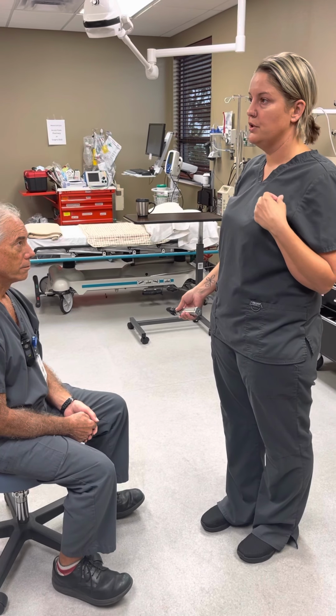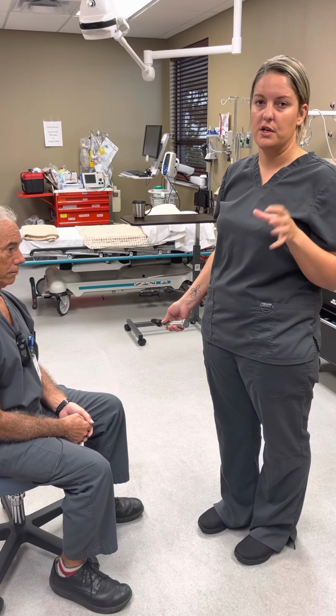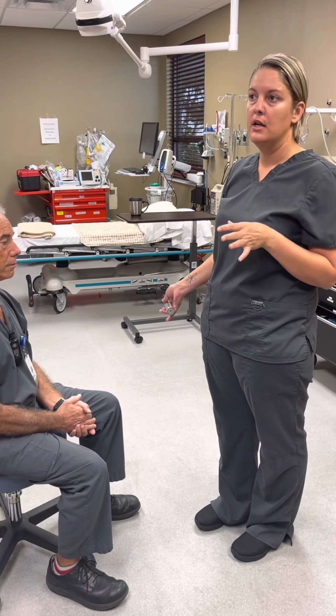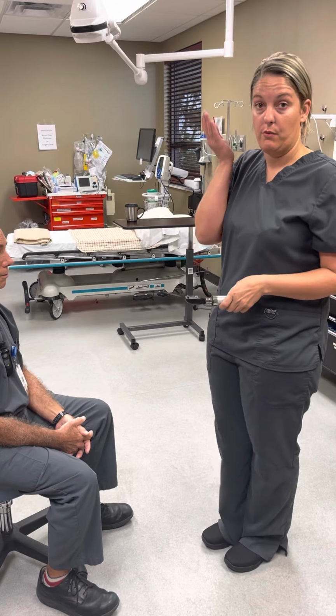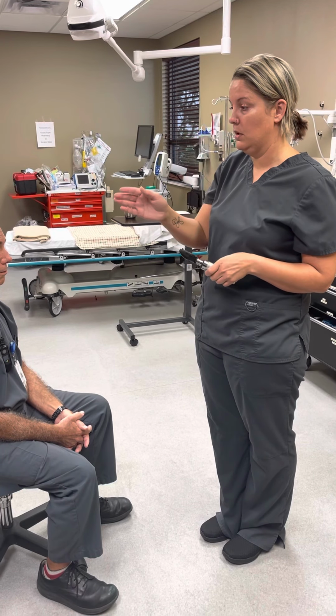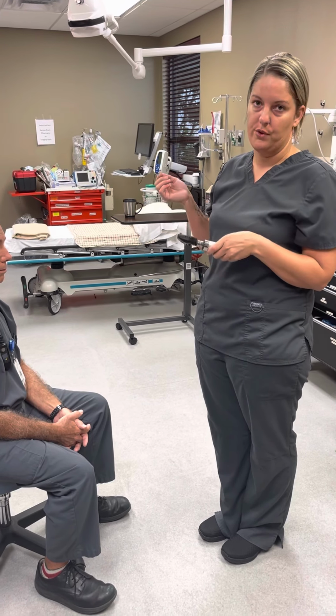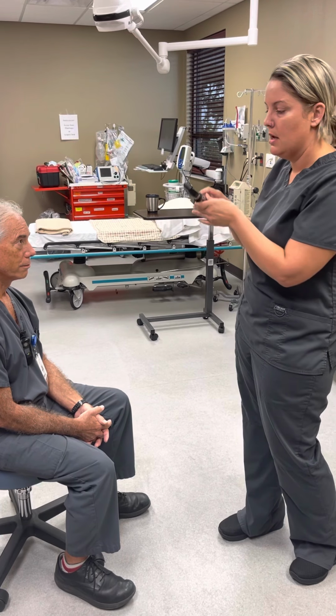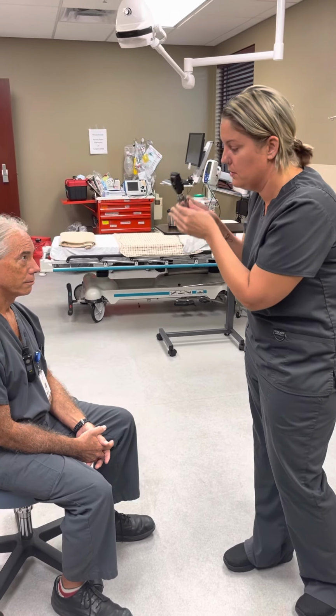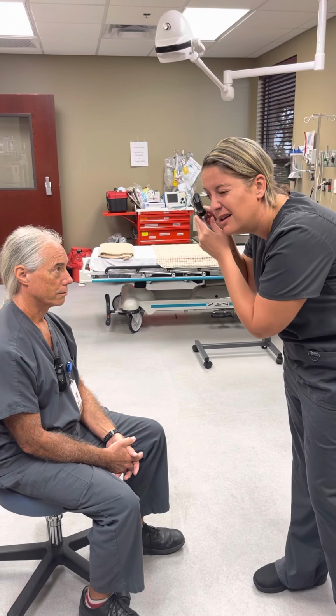And then you test for red reflex, which works best in a darkened room, but for video purposes, we'll have the lights on. So I will look through with my right eye, and I'll look through his right eye, and you should see the red of the retina. Make sure that's on.